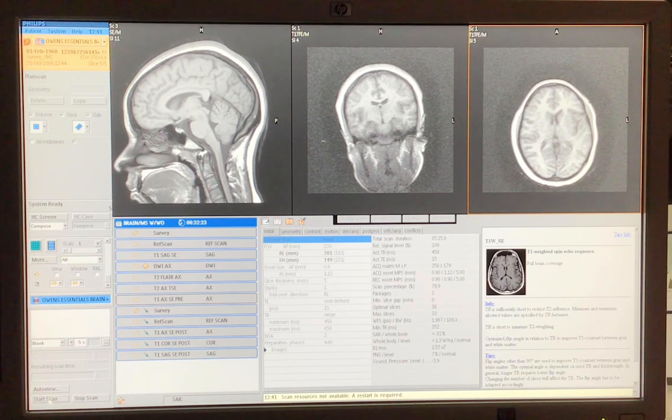And then tell me how much are you going to give. And we're going to look at the chart here that says Optimark. I'm going to look at how much that patient weighs. And if they weigh 220 pounds, I'm going to give them 20 milliliters of contrast. If they weigh 154, I'm going to give them 14. If they go in between it, then just go in between it here. So if they weigh 160, I'm going to give them 15.